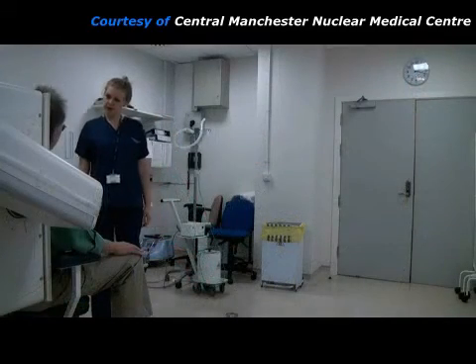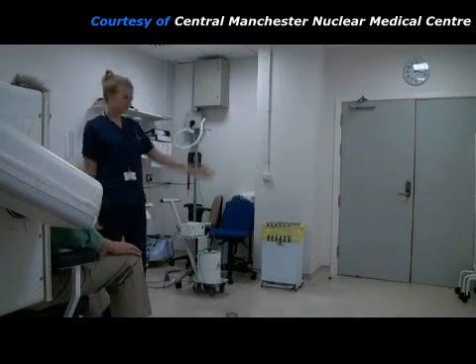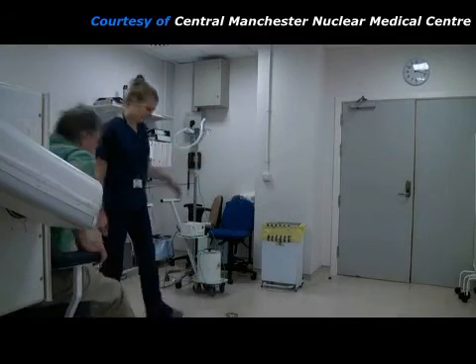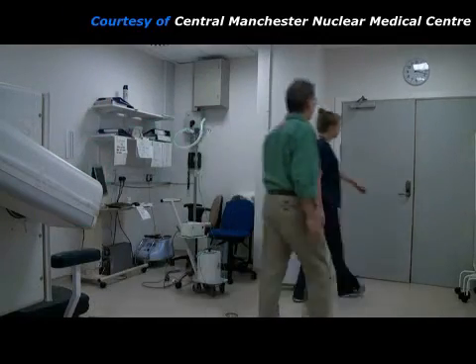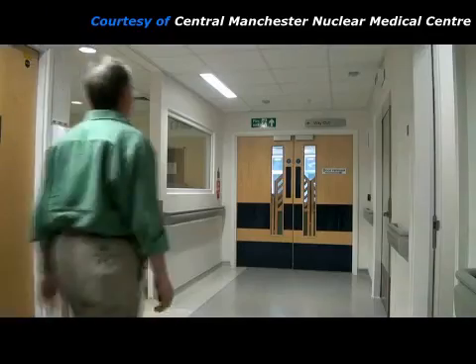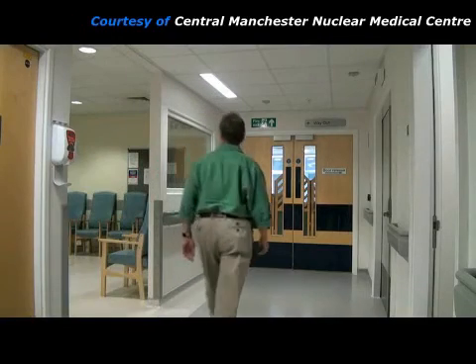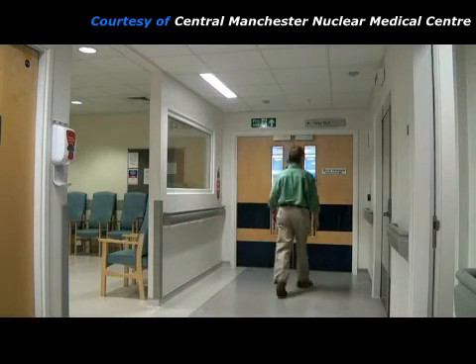When all of the perfusion and ventilation pictures have been acquired, the practitioner checks that the patient is okay, and then he is free to leave the department.